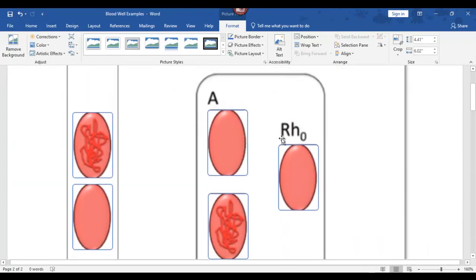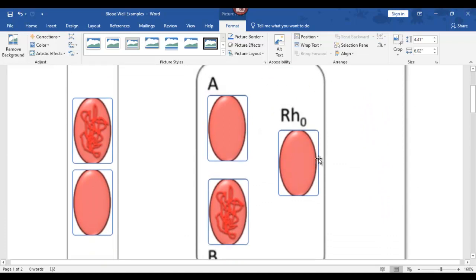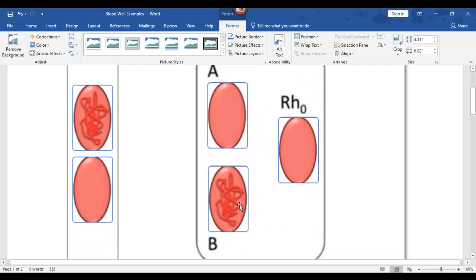So this is a pretty common lab experiment you can do. What you do is you have this little plastic well, and we used to have fake blood, and then we had students who were vampires and wanted to do their own blood, so they had to stick their finger. You put a few drops of blood in each well. Why are we doing this? We're trying to figure out what somebody's blood type is. So this has nothing to do with transfusions. This is literally called blood typing. If you don't know your blood type, this is a very simple method you can use.